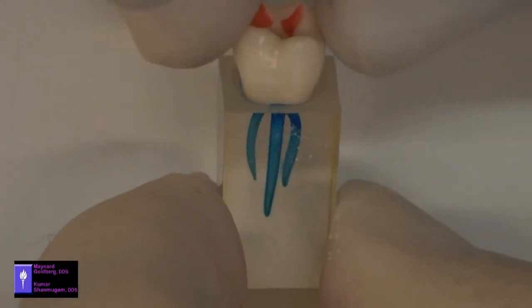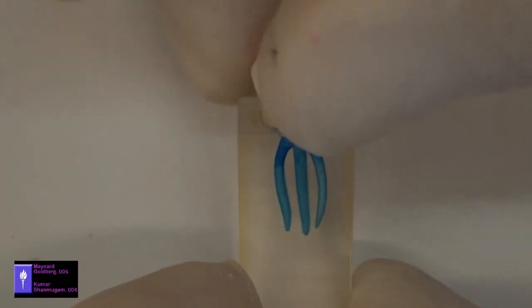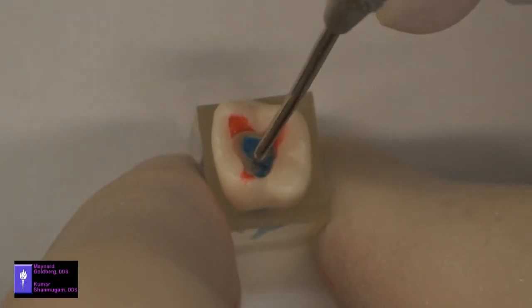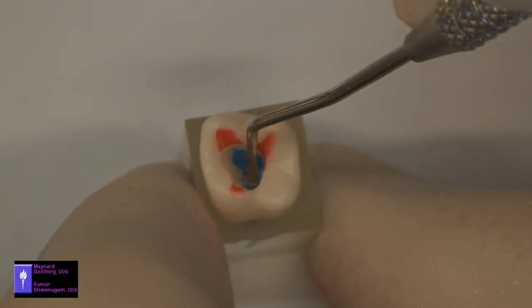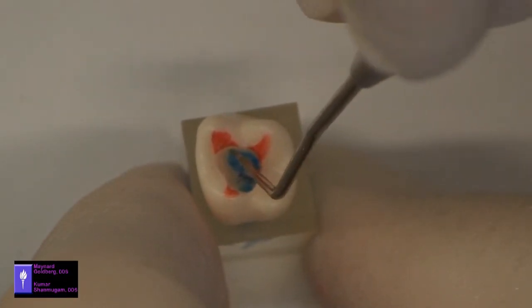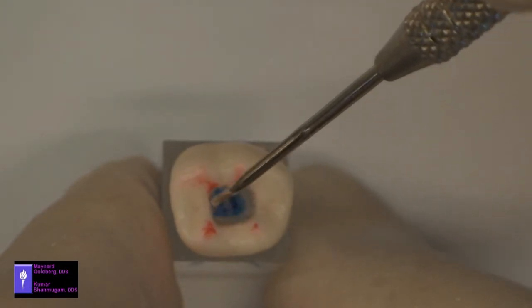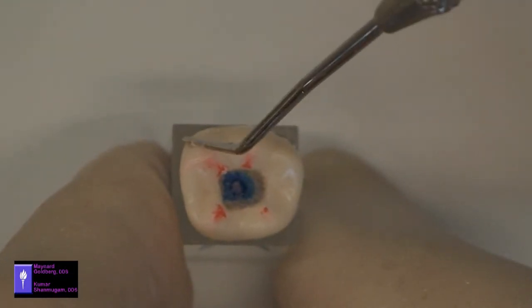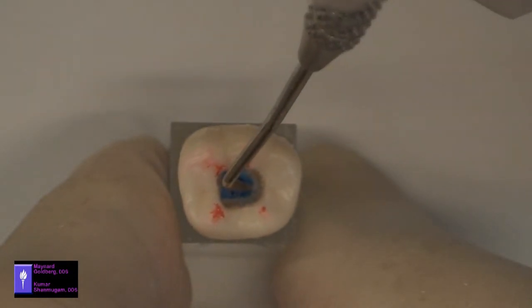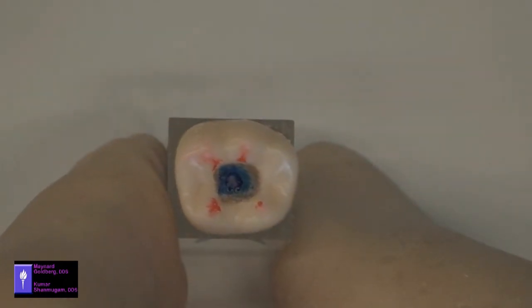And here too, we have not penetrated the floor of the chamber. All the canals are visible at the same time, and all allow for free movement of the files that will be inserted to clean and shape the canal. Note that the outline of the access cavity follows the external shape of the tooth. All the canals are visible and can be entered freely without being impeded. This is a properly designed and executed access cavity.